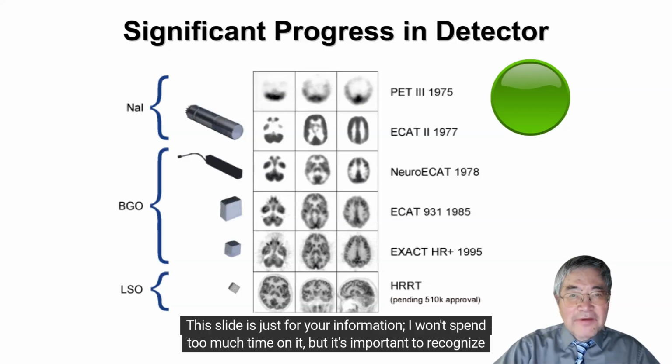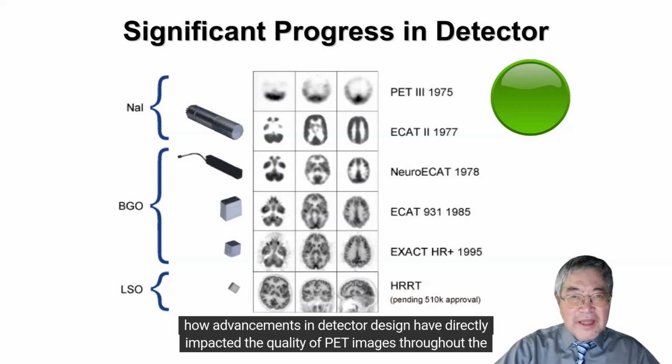This slide is just for your information. I won't spend too much time on it, but it's important to recognize how advancements in detector design have directly impacted the quality of PET images throughout the history of the field.